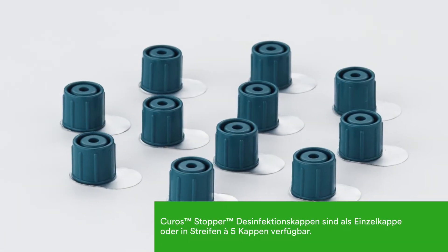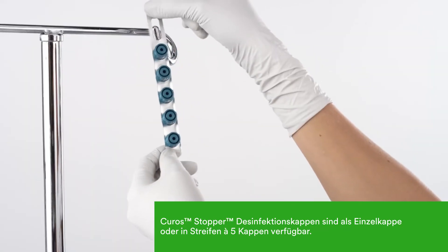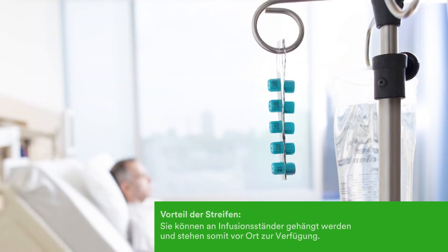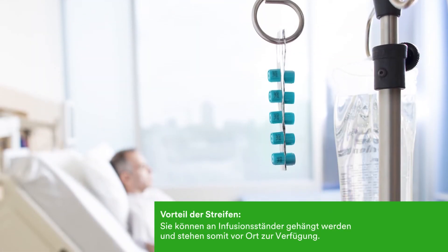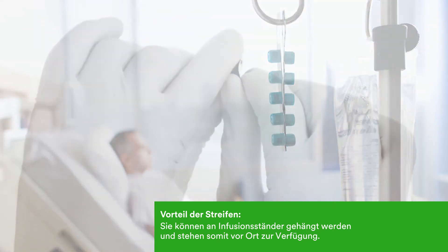Kuros Stopper disinfecting caps for open female lures are available individually or in strips of five. Kuros strips position the port protectors at the point of care for easy access and to provide a visual reminder for compliance.